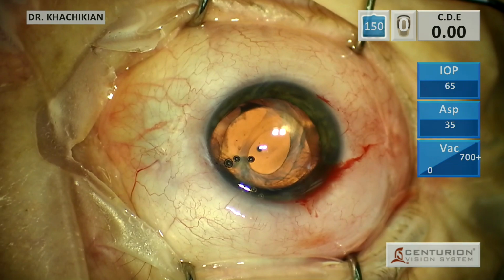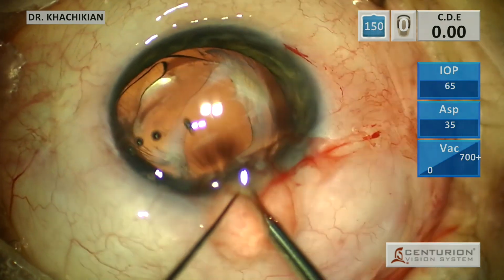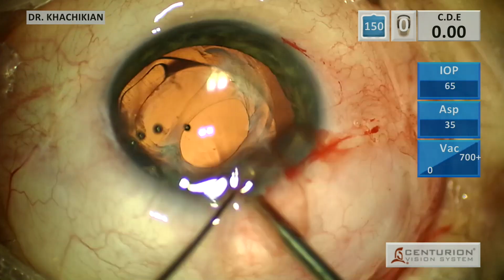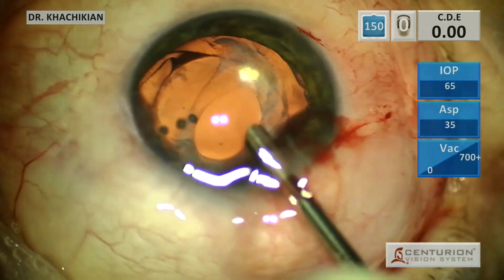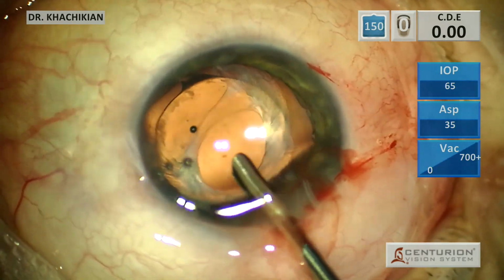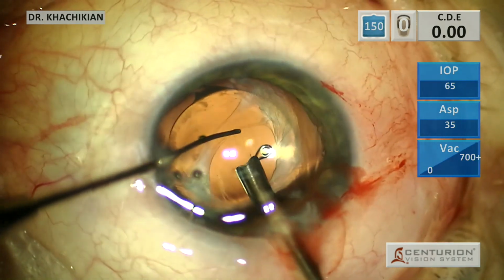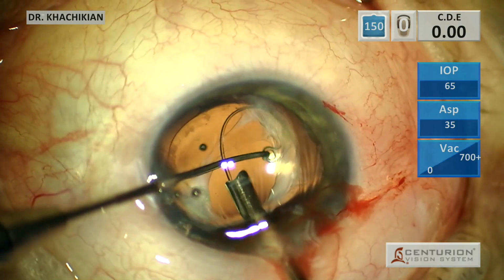In this particular case, I'm very concerned that the leading edge of that capsular tension ring is going to get caught. So as I do with the preloaded capsular tension ring, I use a Sinskey to hold the leading edge of the ring. That allows the remaining part of the ring to expand without a focal point that can get hung up.